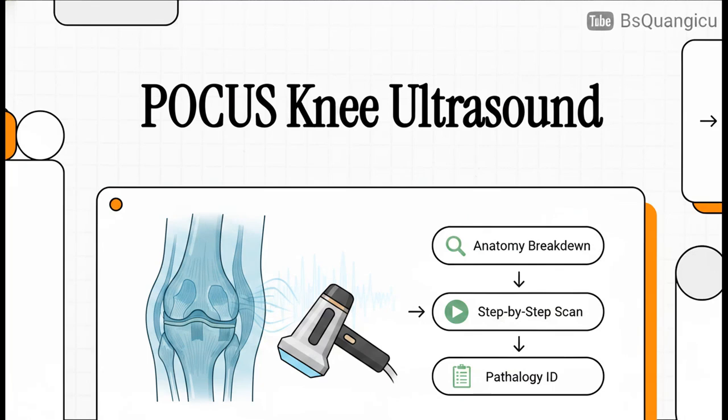Welcome to this clinical explainer. We're going to break down the precise step-by-step workflow for mastering point-of-care knee ultrasound.